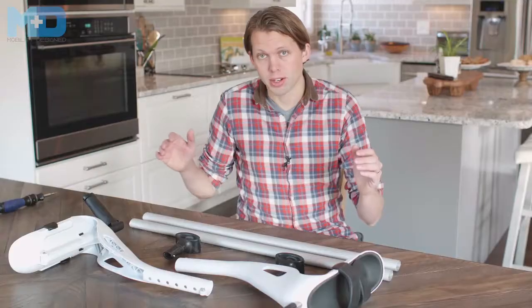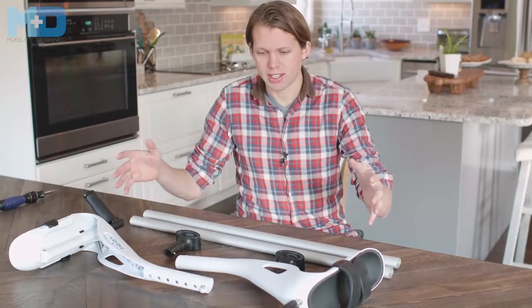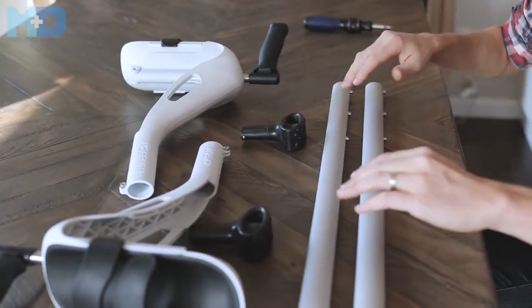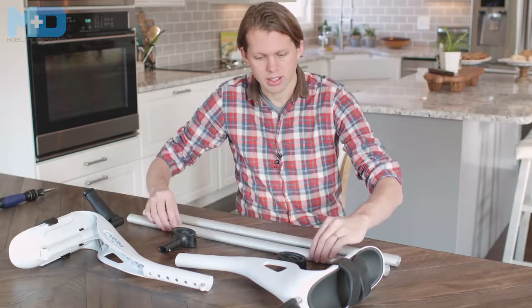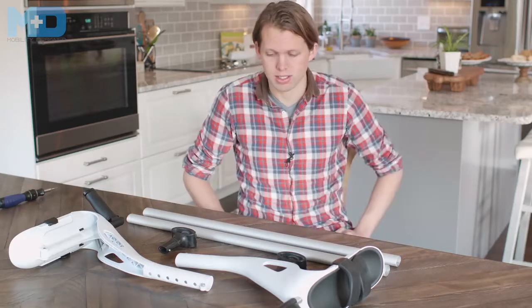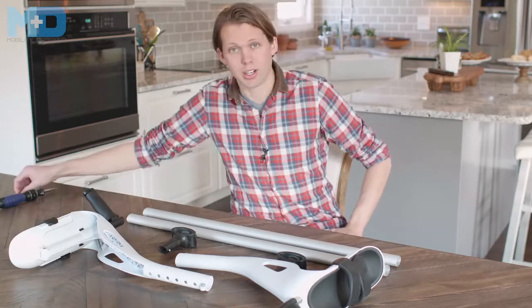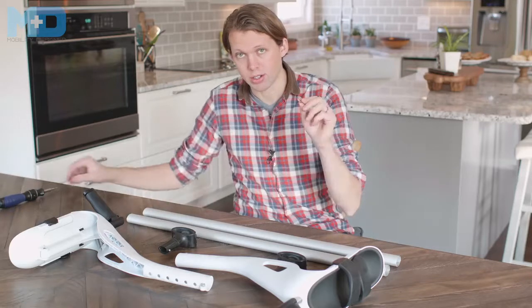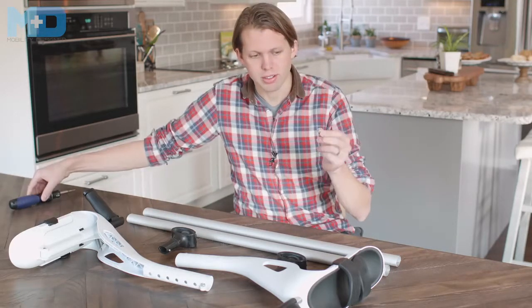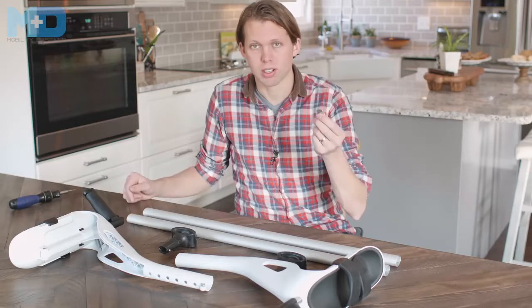When you open your MD Crutch box, the first thing that you're going to see is that there's crutch bodies on top with the feet here, and then below, underneath the cardboard, the two leg tubes. Or if you bought a single crutch, there'll be parts for just the single crutch. The only other thing that you're going to need is either a coin like a nickel or a quarter, or a screwdriver if you desire. When you're out and about, the only thing you need for adjustment ever would be a coin.